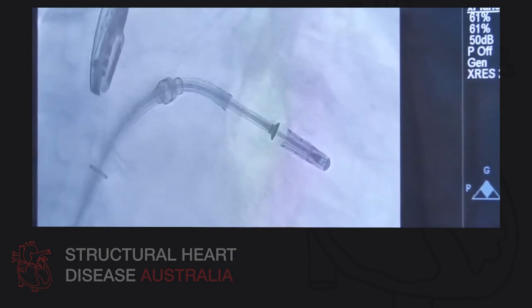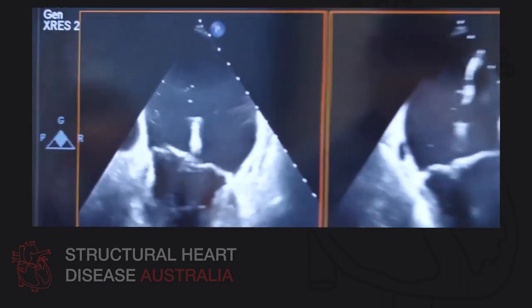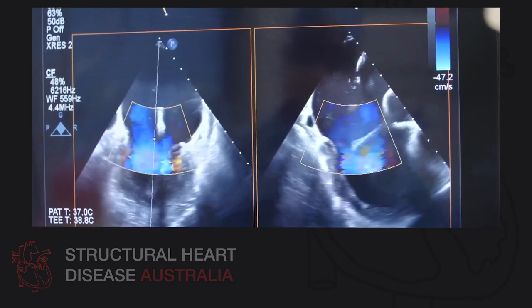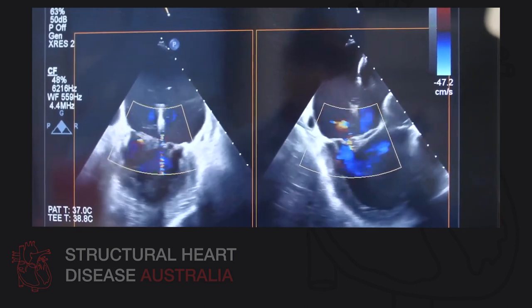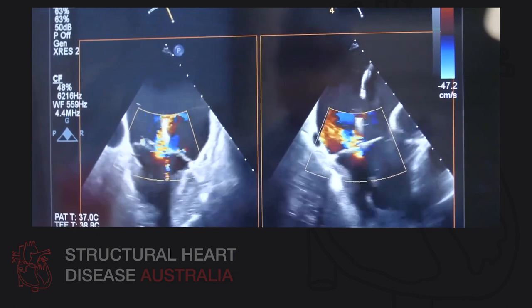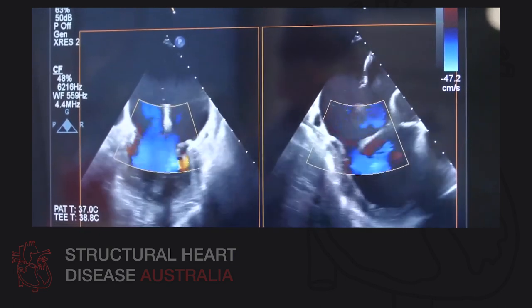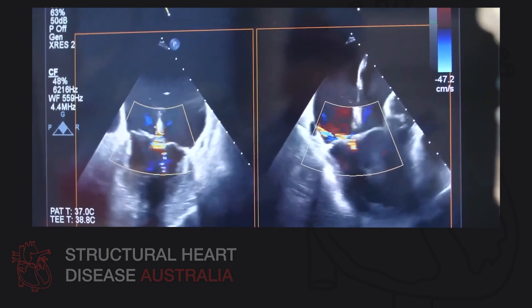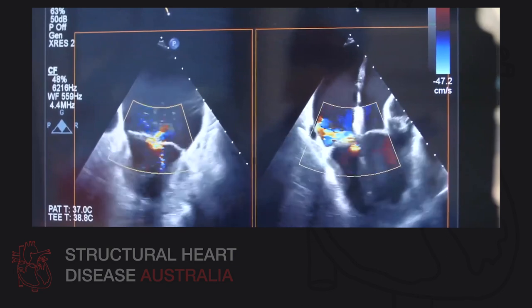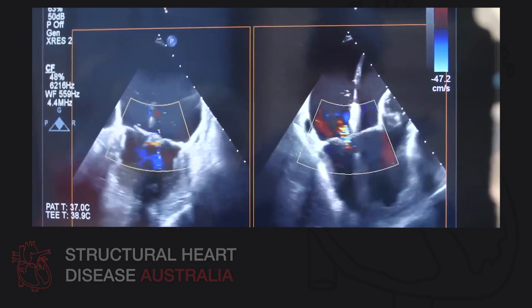You can see now nicely that the clip is sitting above the mitral valve leaflets on those transesophageal echo views. And the idea here is to position the clip to split the color of the jet. So Lisa, looking at the intercommissural view, we look like we're pretty close to splitting the jet. Maybe medial. Yes, so I'm moving the system back medially. I think that looks okay now.